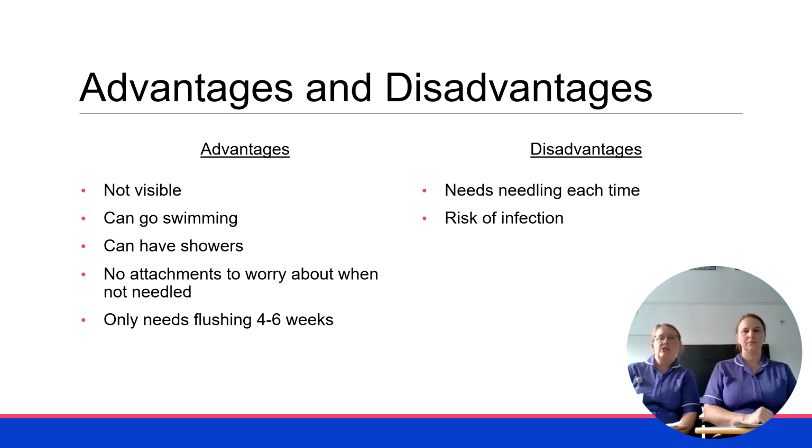And then the disadvantages, again, there aren't many disadvantages. However, it does need to be needled each time. So in a needle phobic child, that isn't the best idea. And there is still a risk of infection with a Portacath.